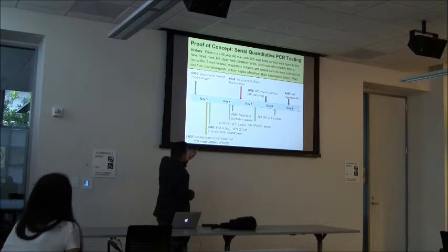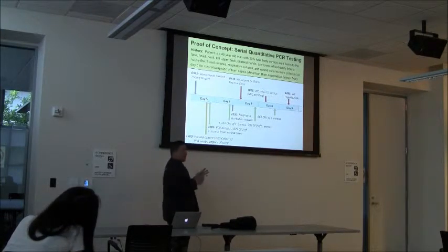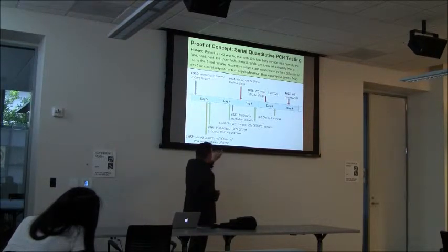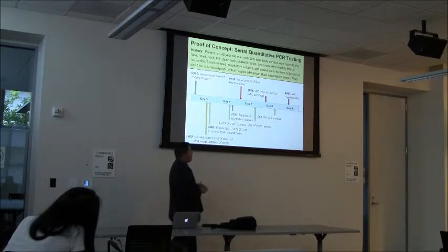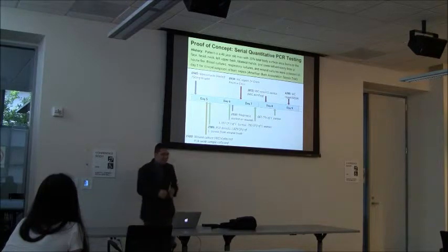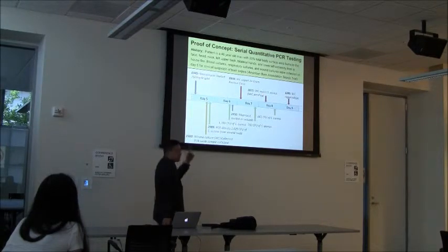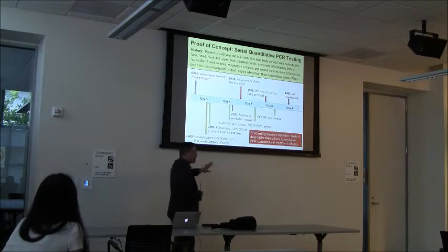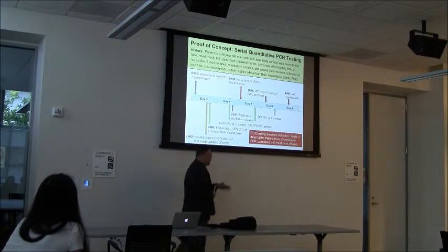Finally, on day 8, the micro lab comes back and says it's Staph aureus, but we don't know if it's resistant or not; we're still testing. Remember, it takes a couple days for that. We see the continued decrease in the number of organisms, and finally on day 9, the micro lab came back and said yes, it's MSSA, methicillin-sensitive staph, regular staph. Well, we told them that 4 days earlier. So PCR, in short, was able to provide definitive results based on nucleic acids 4 days faster than culture.